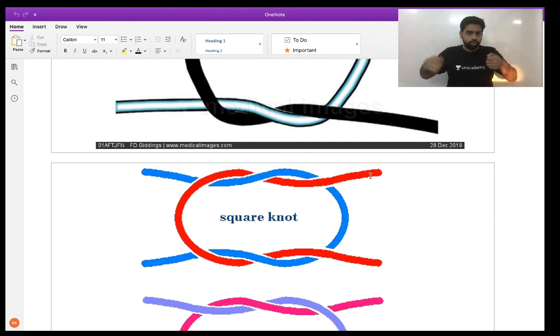So when you take up a suture, the first time you go for 2 throws, and on the next time you only go for 1 throw. Please understand the difference. In technical terms, if you take only 1 throw and then only 1 throw the next time, it is a square or a reef knot. But in the surgeon's knot, you take 2 throws. If you are an intern and you have taken up a suture in the casualty, you will definitely correlate what I'm trying to tell you.